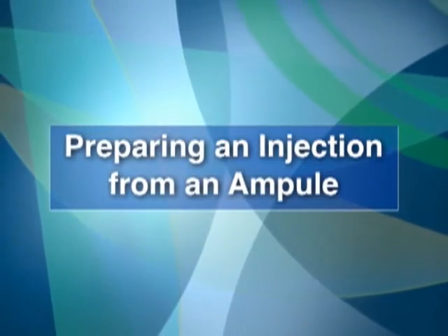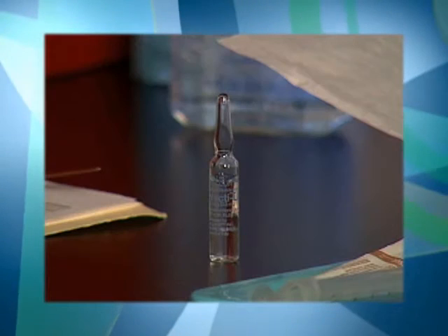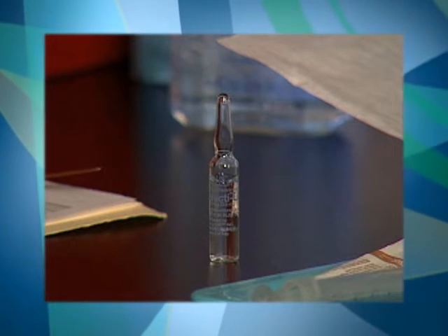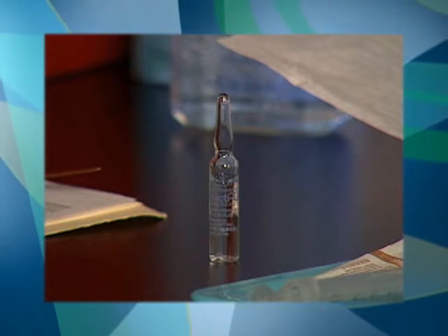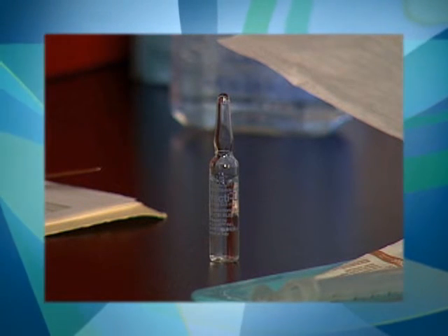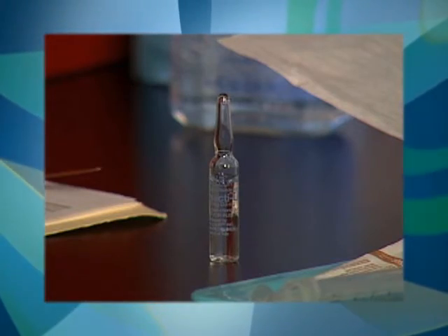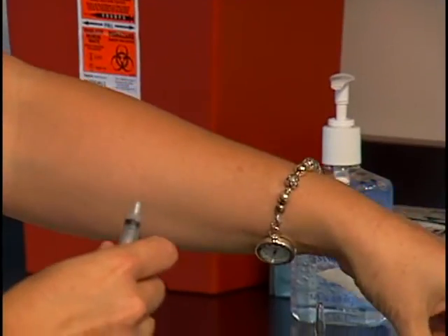The medical assistant will now show you how to prepare an injection from an ampule. An ampule is a small sealed glass container that holds a single dose of medication. A filter needle must be used when withdrawing medication from an ampule. The filter needle prevents glass particles from the broken ampule from being withdrawn into the syringe. First, remove the regular needle from the syringe.